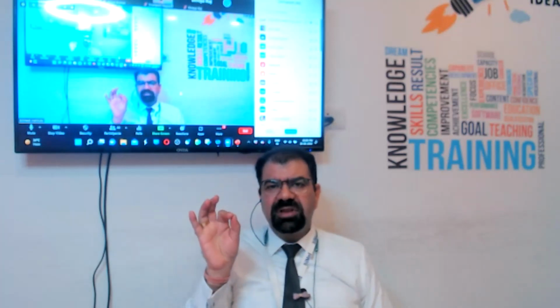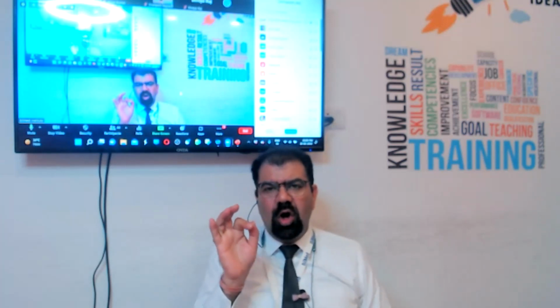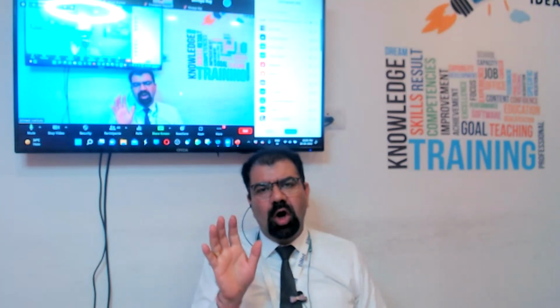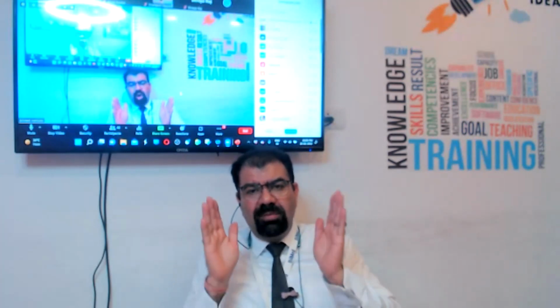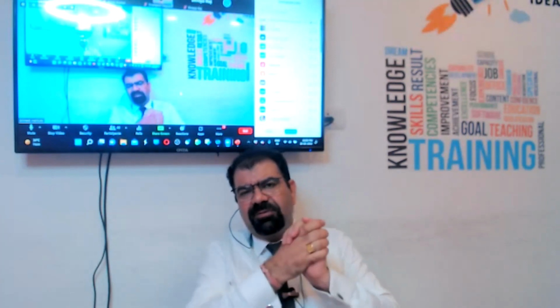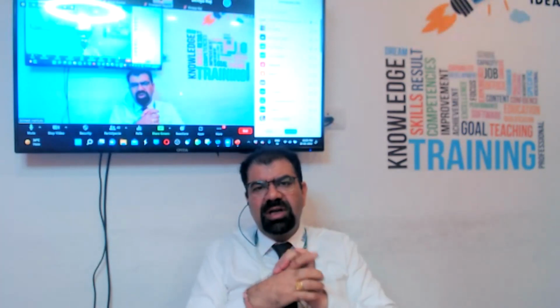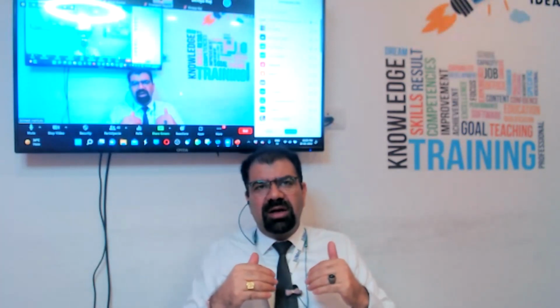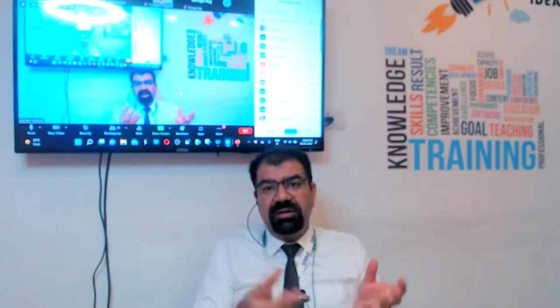What for are we taking the ductus venosus flow in NT scan? To see if there is any suspicion of a cardiac abnormality or any chromosomal abnormality. Why? Because if you have an abnormal ductus venosus in a level 1 scan, with an absent or reversed component, that is giving you a signal that, doctor, there may be a heart defect or a chromosomal abnormality.